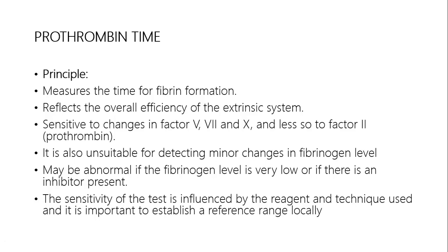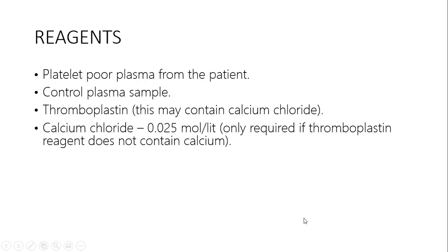Reagents that are being used might vary in different labs, more so with the machine that are being used by different laboratories. So we have one of the minimum requirements to perform your PT. You have your platelet poor plasma from the patient, and of course, we should have a control plasma sample.